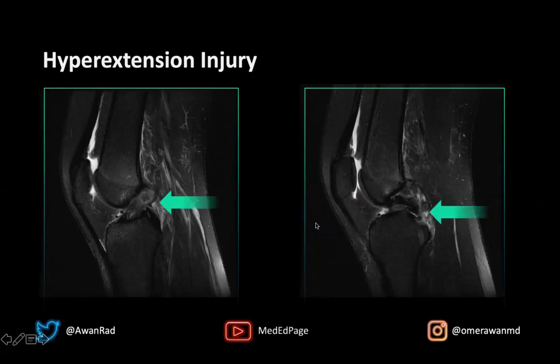Along the PCL there's a frank tear distally. Notice that we lose the dark contour of the ligament. Remember, ligaments are always dark on all MRI sequences, and we lose the contour of this curvilinear ligament more distally before it attaches to the tibia. So there's definitely a frank PCL tear here and at least a sprain and partial tear of the ACL on this image.